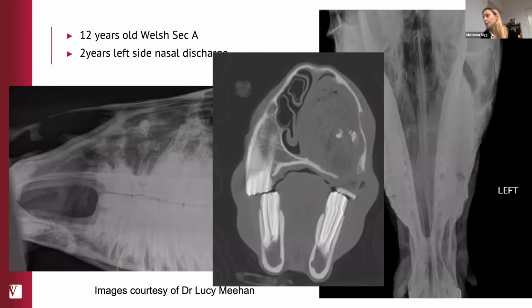And in fact, this horse did undergo CT, and you can see the large fistula that was present at the level of the extracted tooth, and the large amount of food impacted within the nasal cavity. This is very chronic, as we can see by the dystrophic mineralization within the material, and also by the degree of deformation of the maxillary bone, nasal septum, and palate.